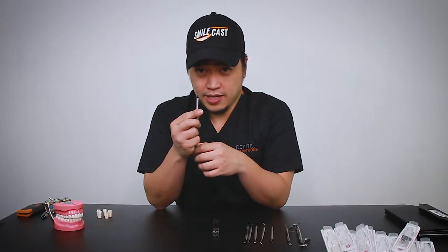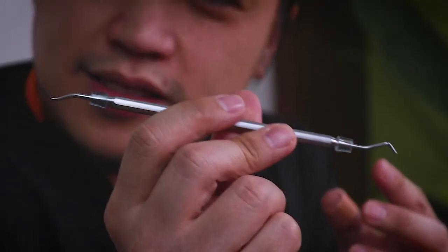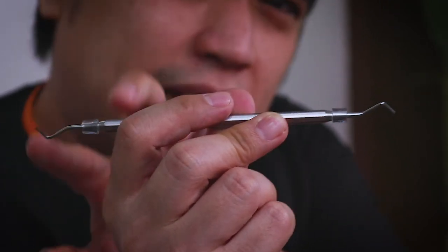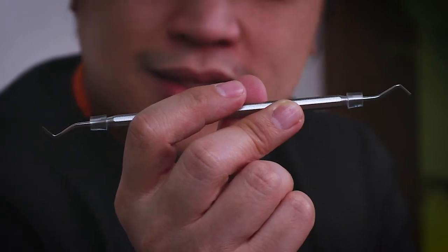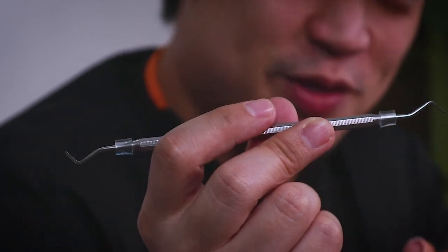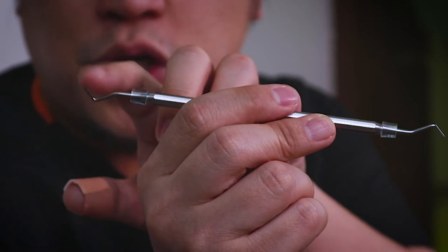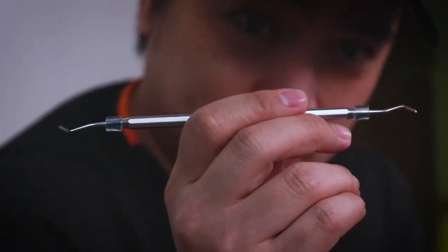Now we have the Hollenbeck carver. If you take a really close look at this, it's really sharp and it's angled in a specific way at the tips. I really like this because when you're trying to remove line angles — especially in dental school — it's quite hard to control the bur. When you're trying to remove the line angle of the bur, sometimes you just cut it all or you actually ruin your prep. With this, you can just scrape through the preparation and smooth out those line angles to create the bevel that you need.